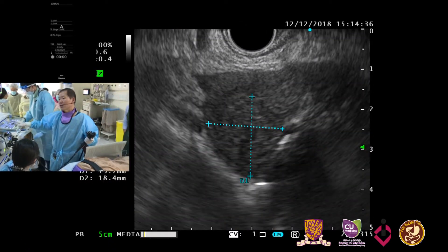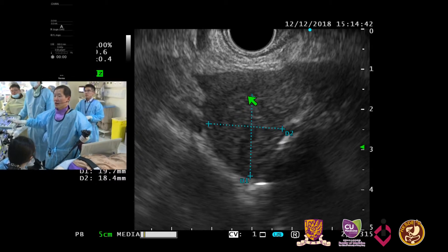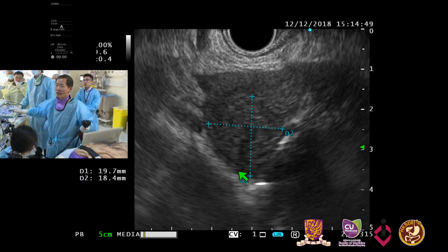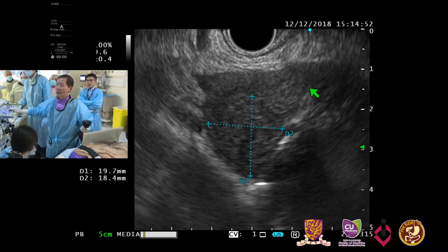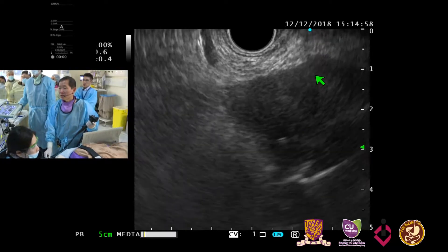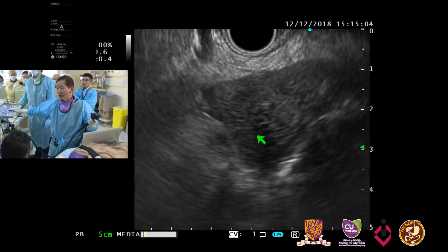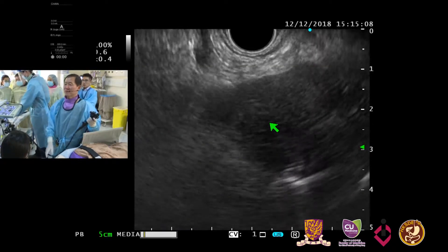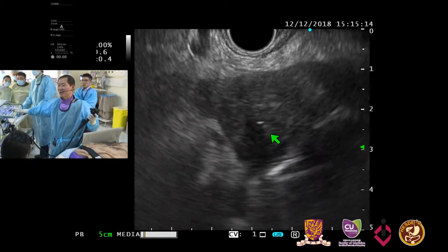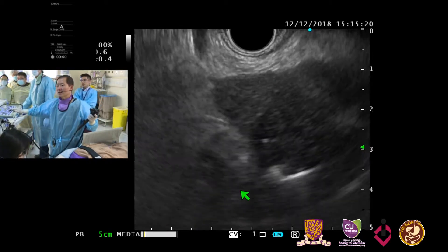I got the S1 image now. You may appreciate the abscess area — it's very subtle. I think this is the abscess area. The B-mode echogenicity here is different from the normal part of the liver. You may see some low attenuation area in this part. This is the trans-gastric view. When I stand up, it became easier to show this S1 part; when I sit down, it was difficult. This area is the portal vein area, the hepatic hilum area.